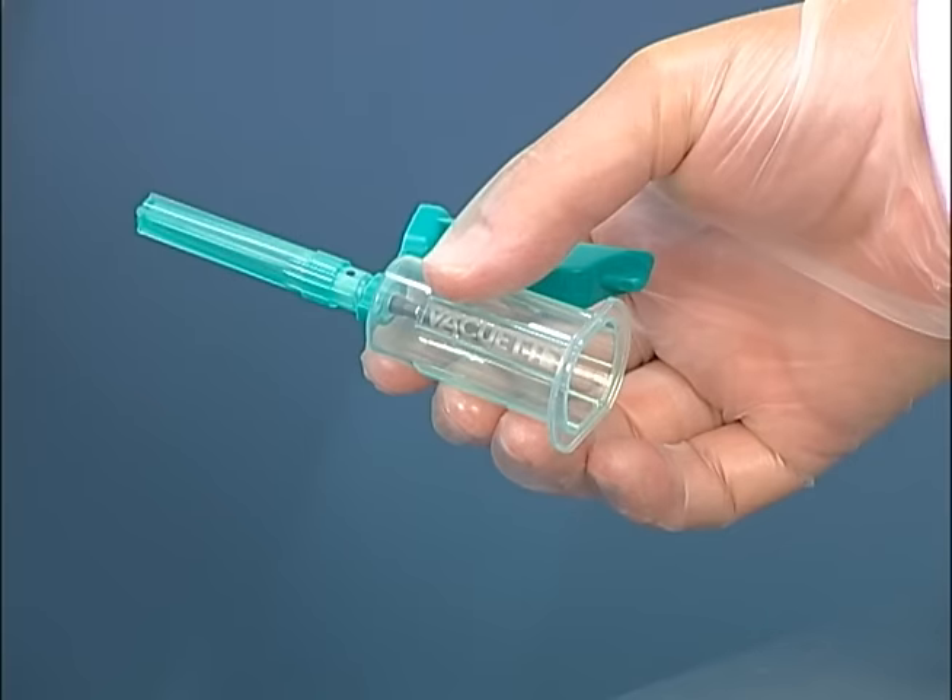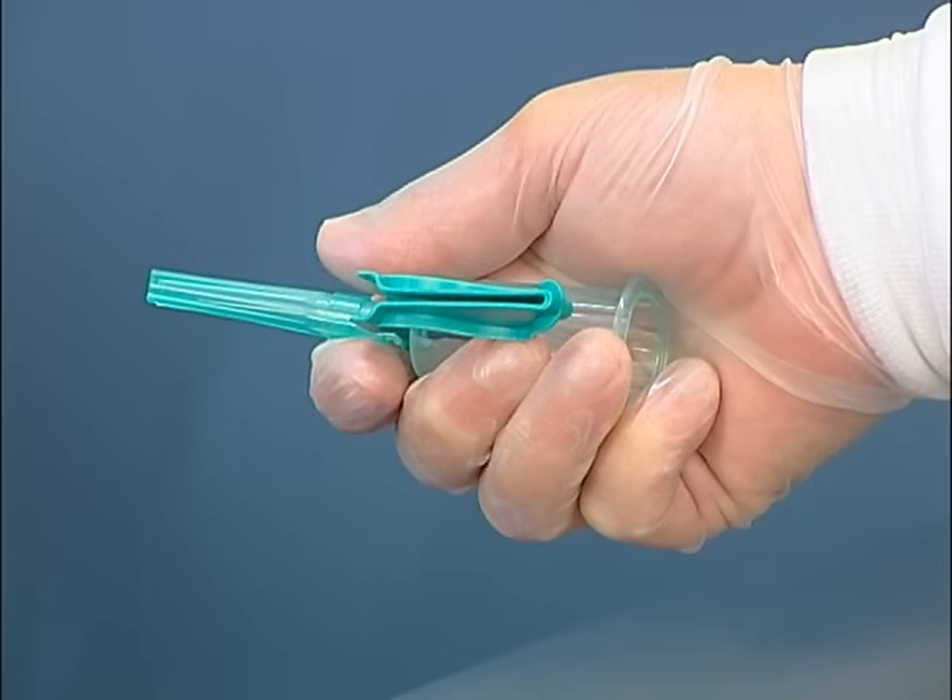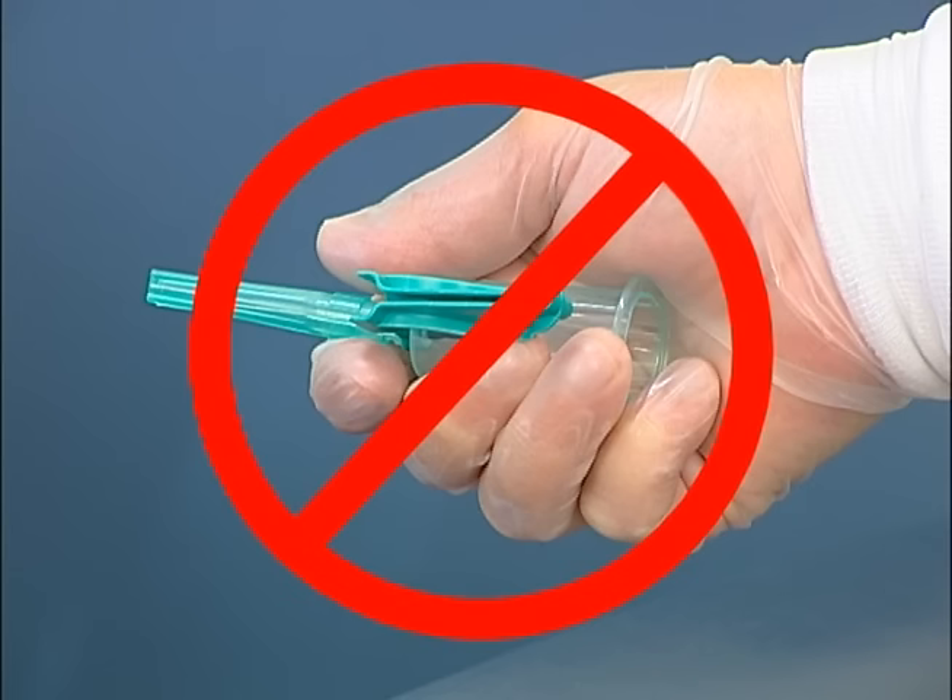When using a tube holder assembly, hold the assembled device between your thumb and the tips of your first three fingers. This allows ample room to manipulate the tubes in and out of the holder. Do not grasp the assembly in the palm of your hands, as your fingers will obstruct your ability to visualize the draw, tube exchange, and the angle of entry.